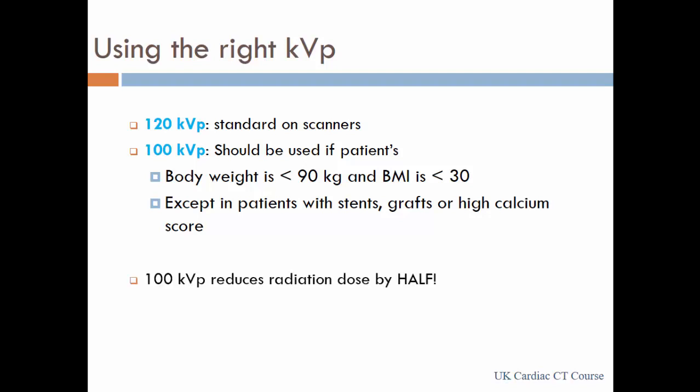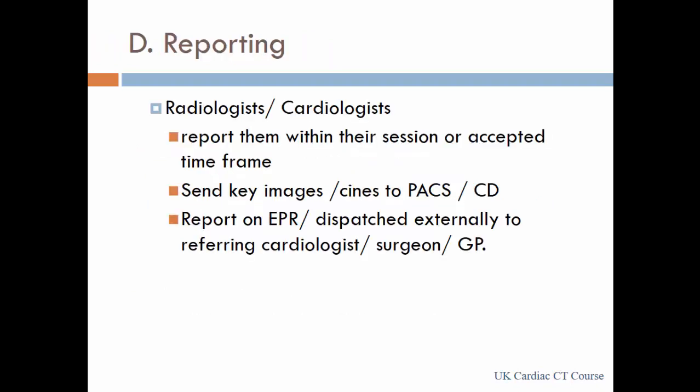The thing with 100 kVp is that compared to 120 kVp, it will reduce the radiation dose by half. So it's a massive dose reduction by using 100 kVp.